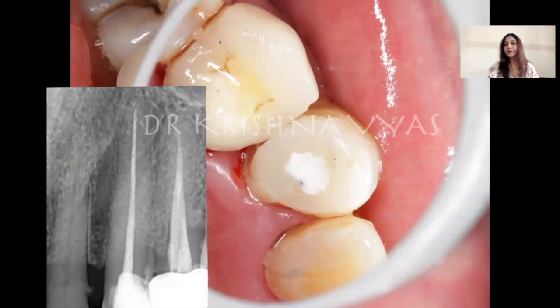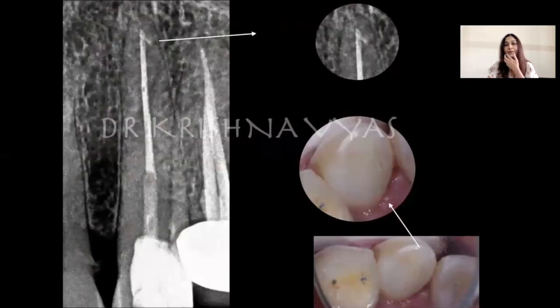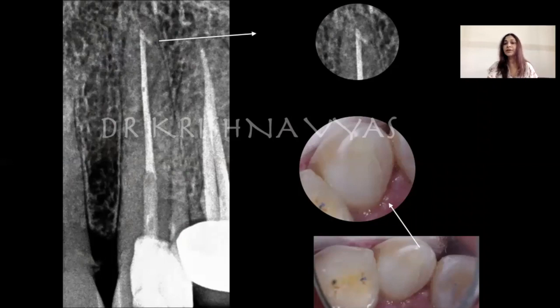In this case, the working length was almost 31 millimeters. We got the appointment for post and core, but the patient did not turn up due to COVID times and came back after two years. The tooth was well preserved because we reinforced it at the beginning — otherwise it may have fractured or had leakage if we had not done this pre-endo buildup with permanent restorative material. After two years, we did the post and core. Since the patient didn't want crown lengthening and a ferrule for the crown, we left it as a direct post-endo restoration.